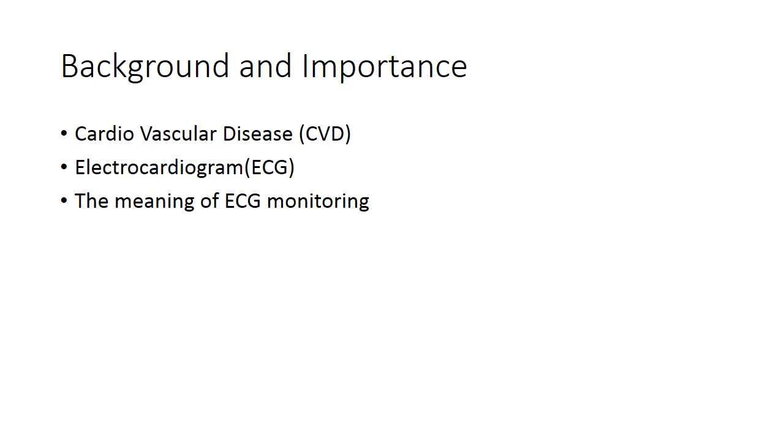Electrocardiogram, or ECG for short, is the basic method of detecting cardiovascular disease in current medical technology.